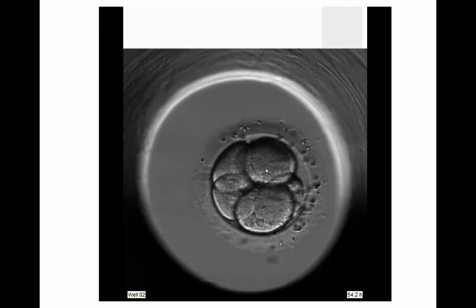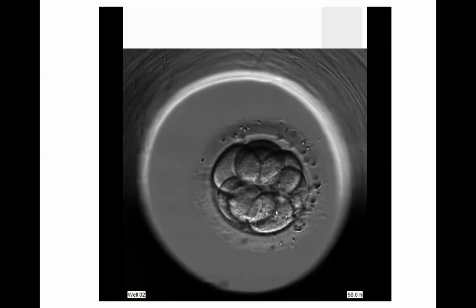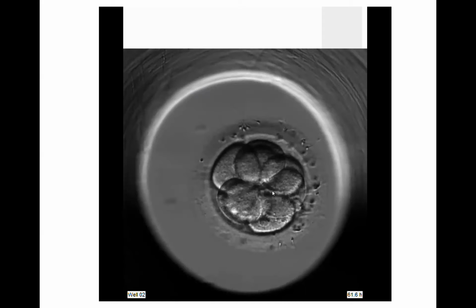So these embryos are cleaving. Right now, it's about 57 hours after fertilization. So right here, it's around day 3 of embryo development. And on day 3 of embryo development, we like to see embryos somewhere between the 6 and 10 cell stage of development. I'll go into that in a little bit more detail.